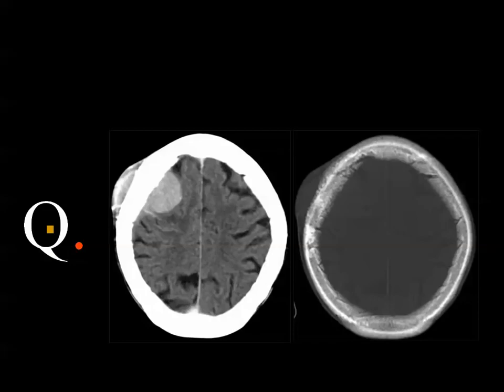No, I told you hemangiopericytoma, which is considered an aggressive meningioma. Hemangiopericytoma. Based on what? Hemangiopericytoma is a big lesion that destroys bone. It is associated with bone destruction. But here, the bone is not destroyed. On the contrary, the bone is sclerotic.